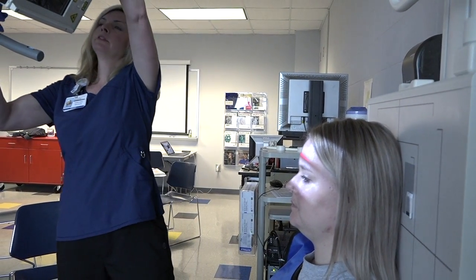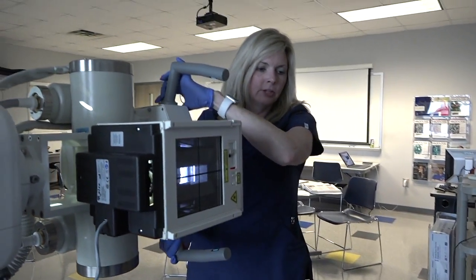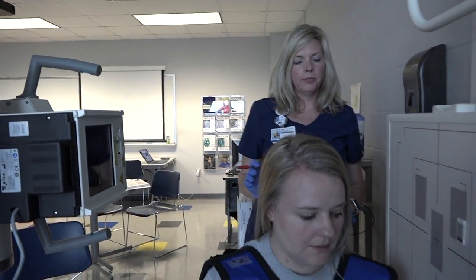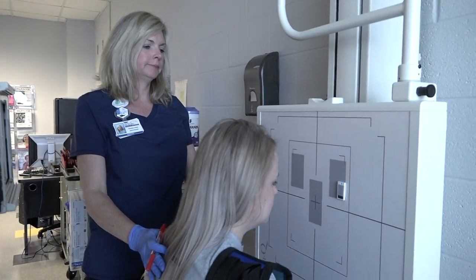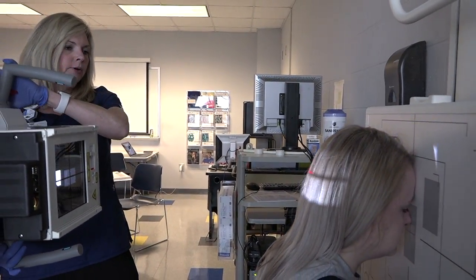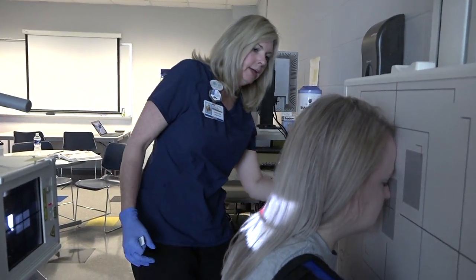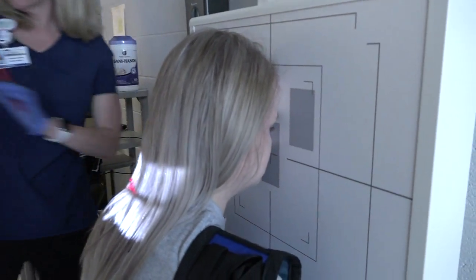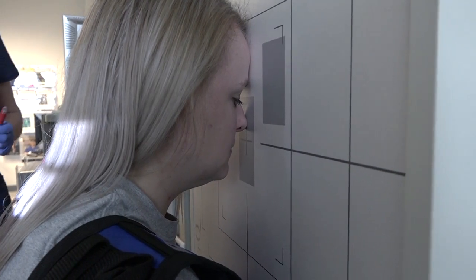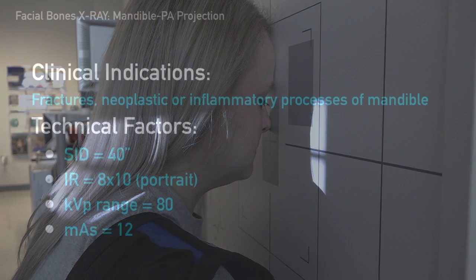Our next projection is a basic PA — we'll take the angle off. Have the patient turn around and put their nose and forehead against the board. Our centering for the PA is at the junction of the lips, the LML. We're already lined up there, so we'll line up our tube and bucky.